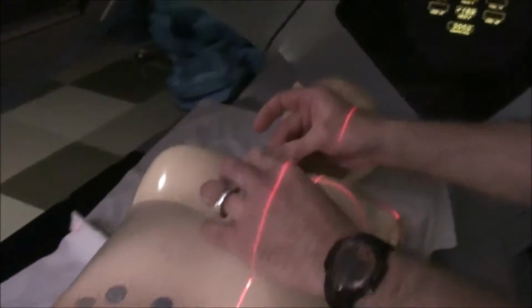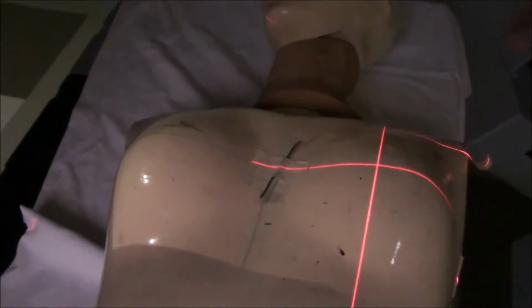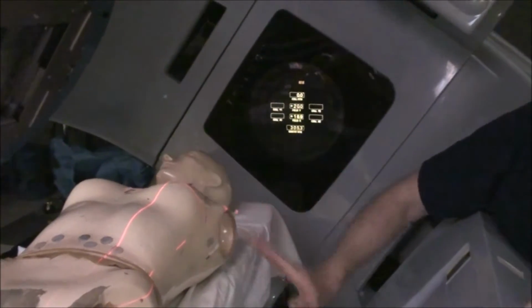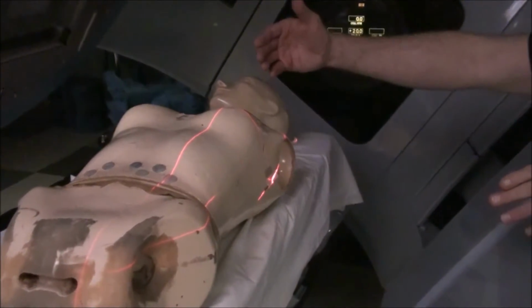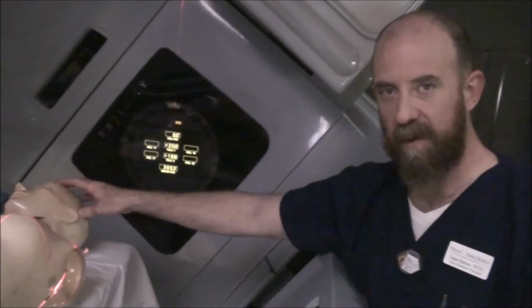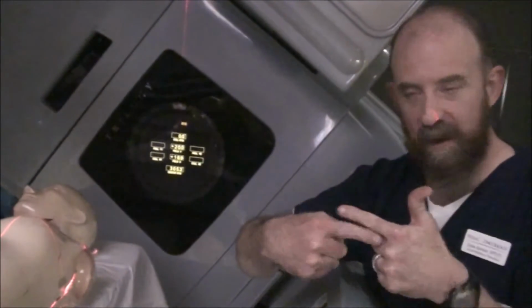What that's going to do radiographically is demonstrate when you have both the wires crossed, then you'll know that both your entry and exit point are parallel opposed to one another. If you'll recall, treating a tangential breast is no different than 2 laterals. It's just tilted, okay? And so if you have a bilateral whole brain that's midline, you know that at 90 and 270, your CRs are crossing.